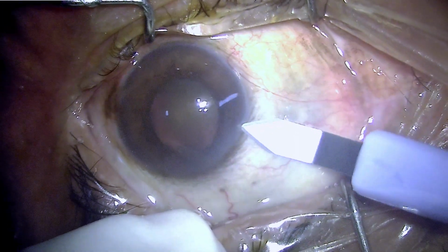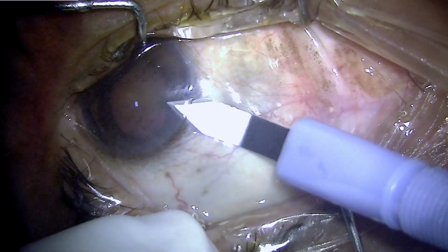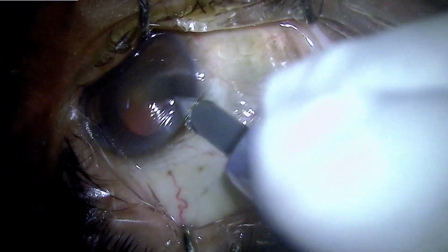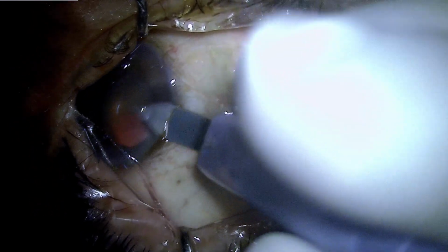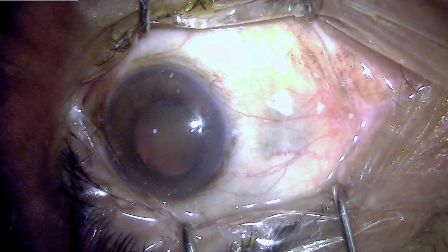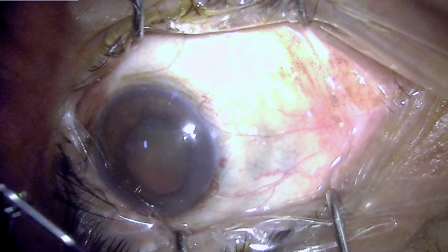The pupil has been dilated and this is a little better than what we had in the OPD, and we have started the incision at the steep axis, which is at 170 degrees. We are also planning to have an opposite clear corneal incision so as to neutralize the pre-existing astigmatism without the use of toric IOLs.